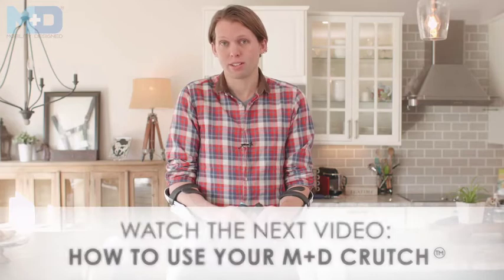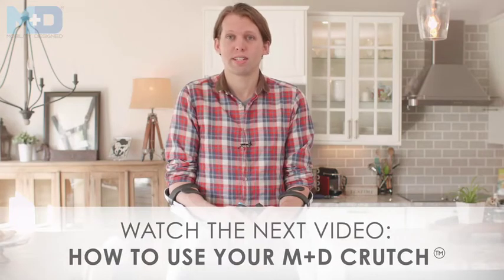Now that your MD crutch is adjusted to fit you, you're ready to get moving. We have another video called 'How to Use Your MD Crutch' that teaches you some tips and tricks.